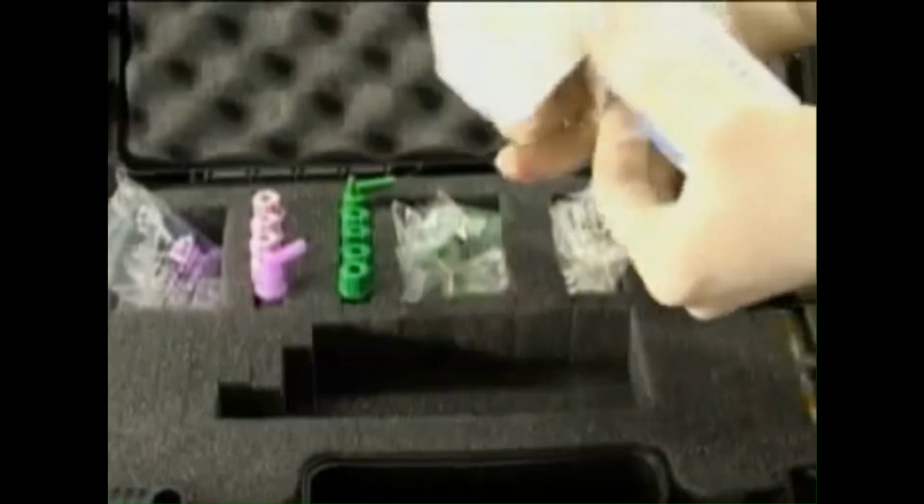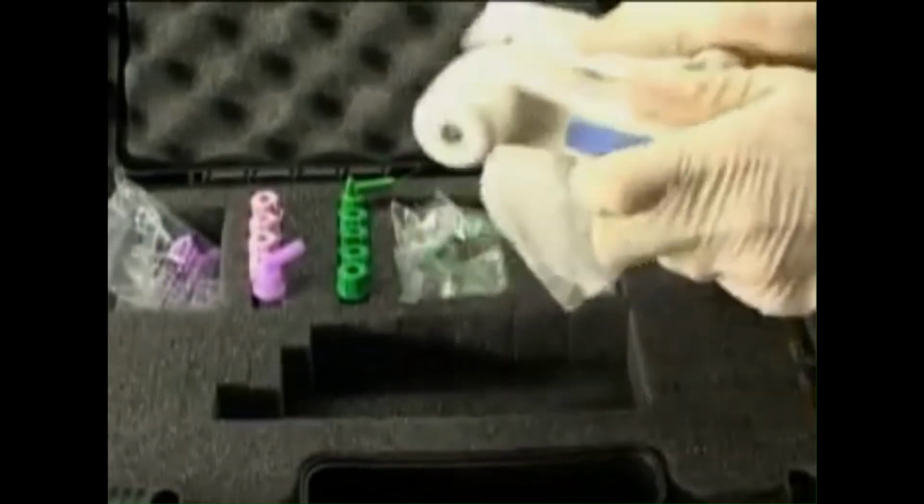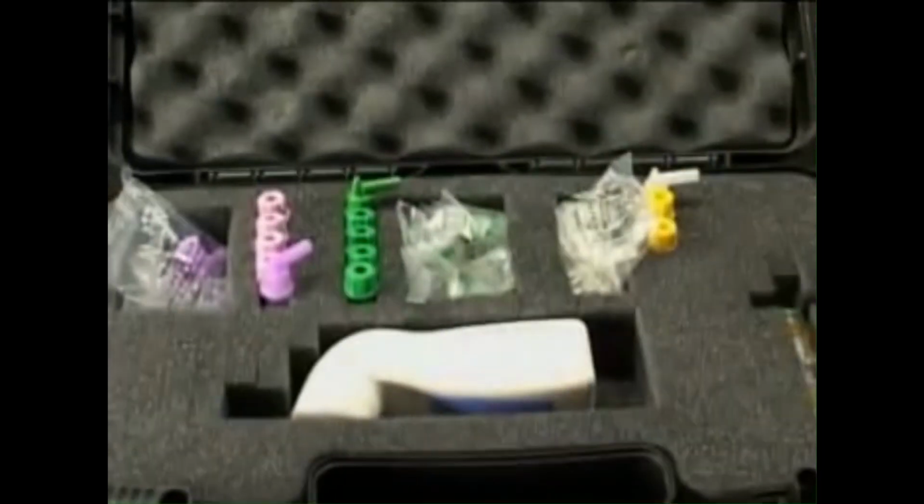For infection control, the Inovac can be cleaned and disinfected by wiping the unit down using your standard disinfecting procedure. A disinfecting wipe works very well.